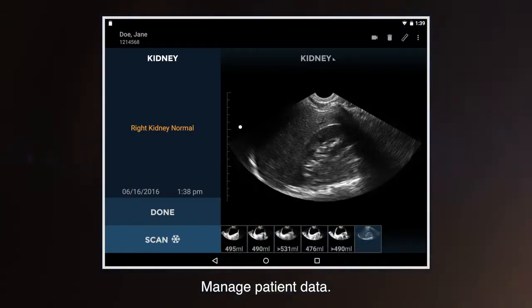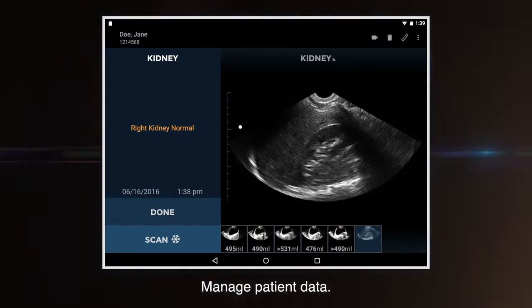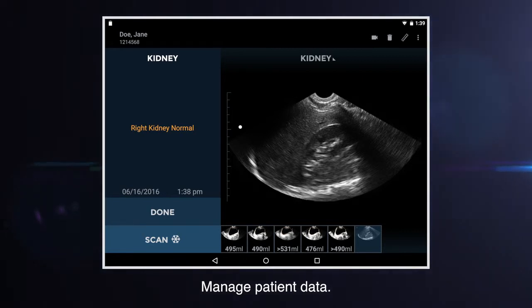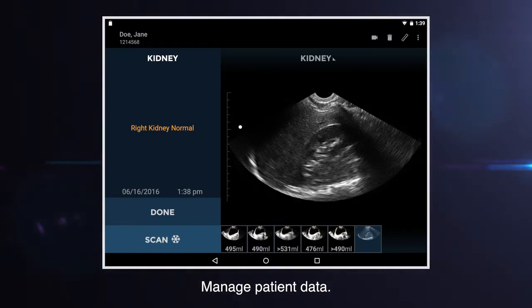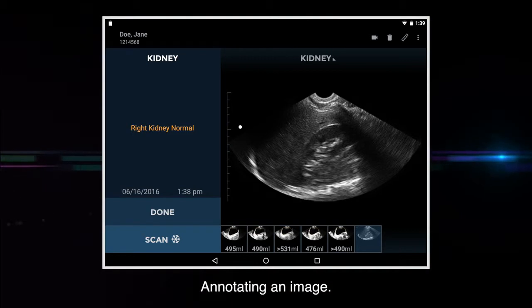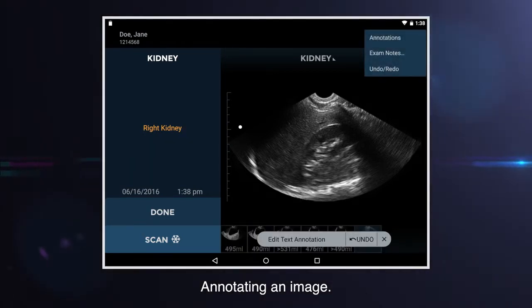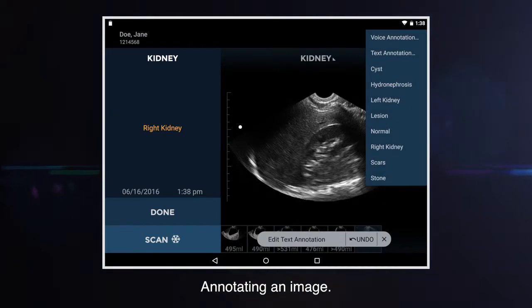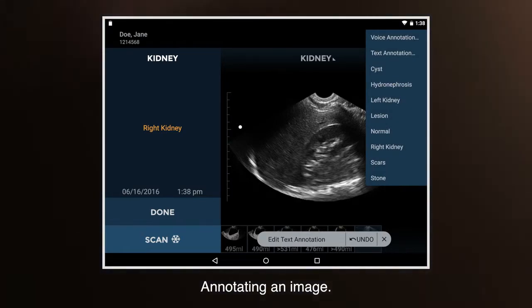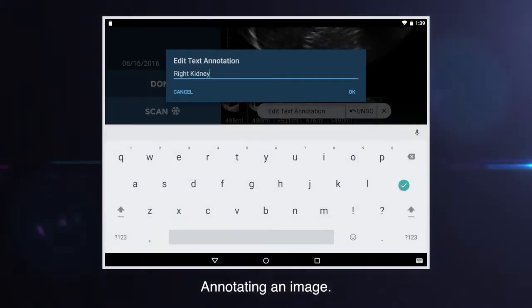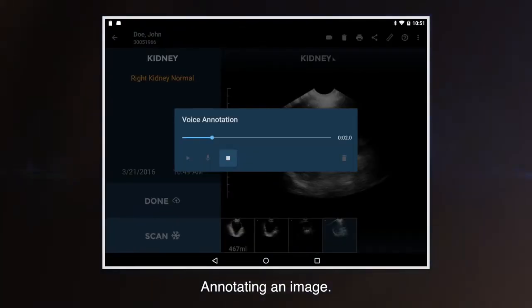Patient data is managed as exams, an alternative name for studies. Exams may contain one or more images and measurements, and each exam is attached to a patient name. Any image can have a single annotation attached. A drop-down menu of annotations is available, and an annotation from the list can be selected, or a custom annotation can be entered by selecting text annotation or voice annotation.